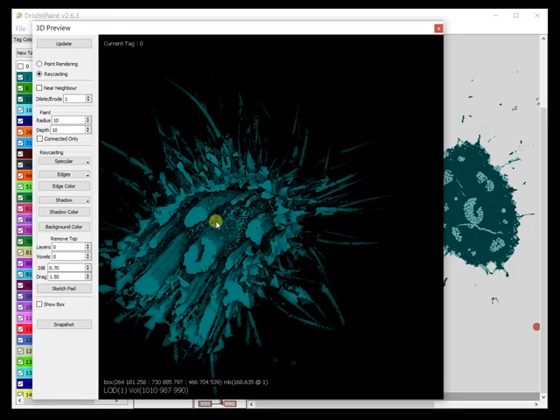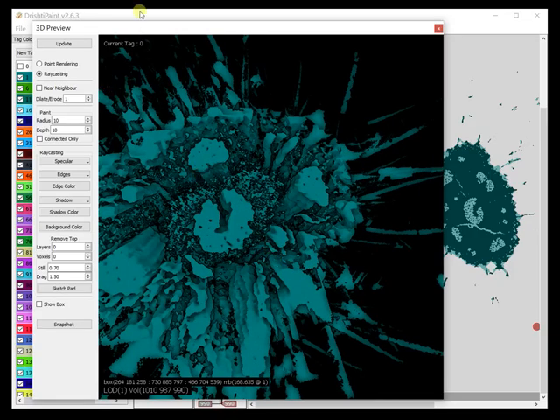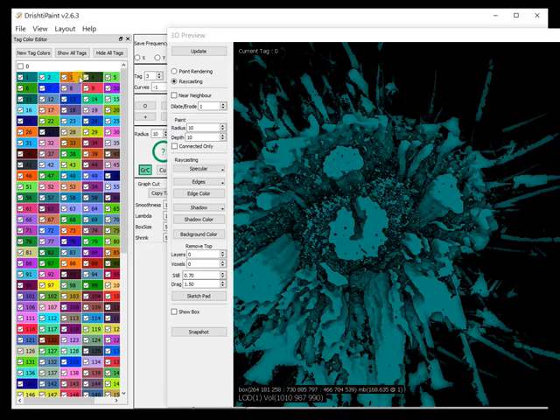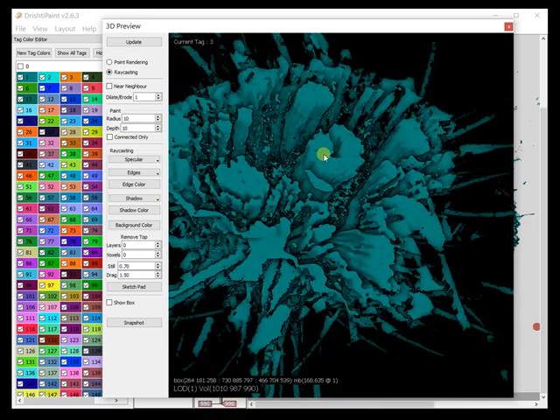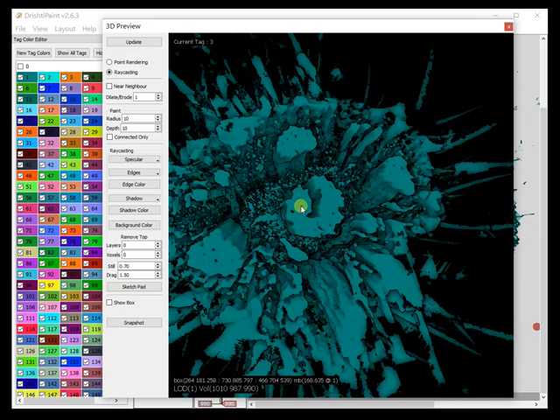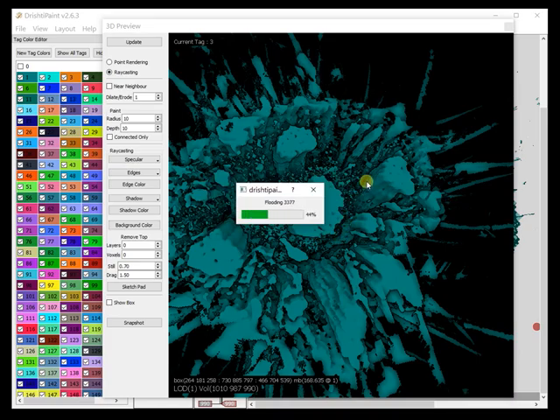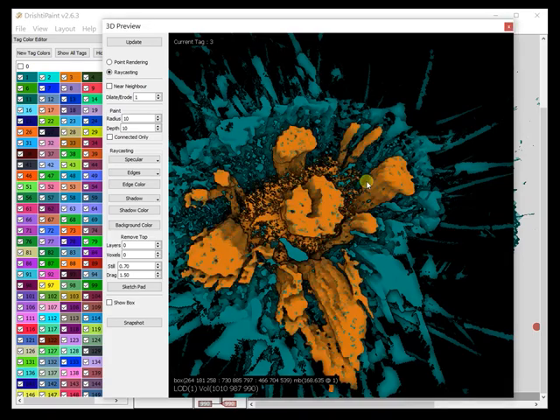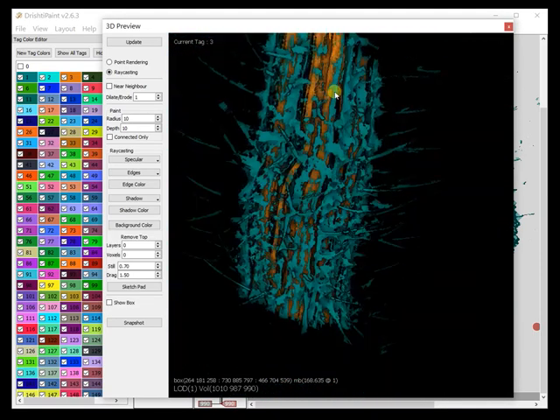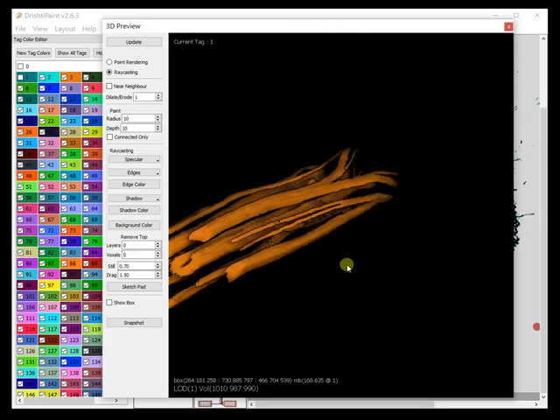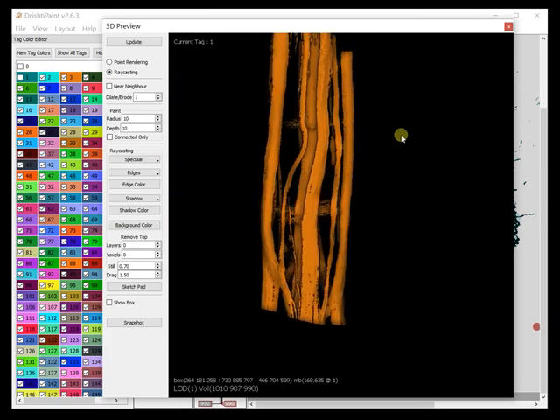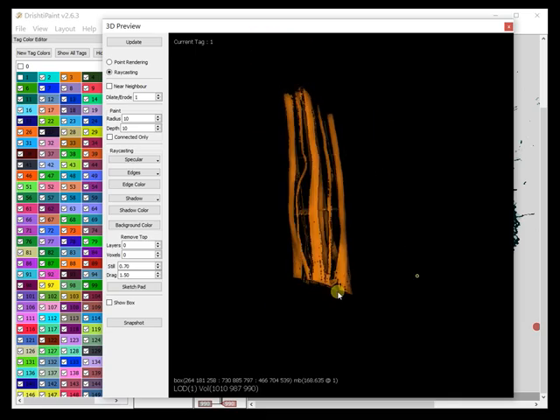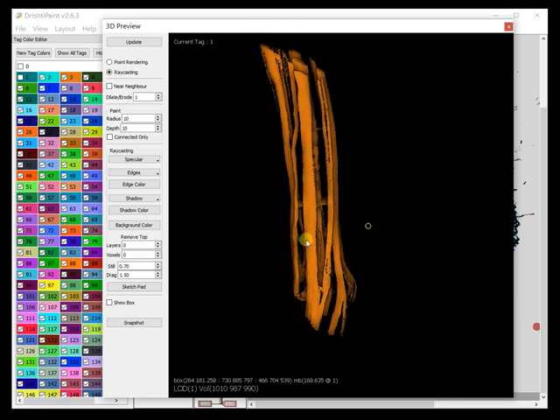You can do that easily. Let's say tag 3. We are correct tag 3 and then we can just hover over this region here and then press fill. These are all tagged. Now if we just turn off one these are the interior. This is what we wanted to extract and this is what we have.